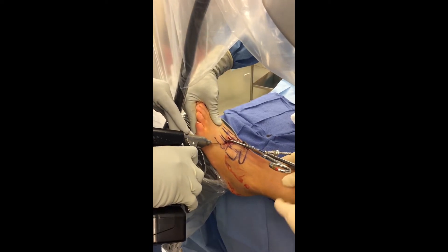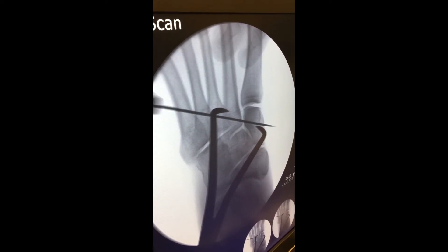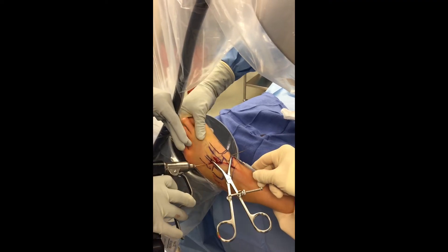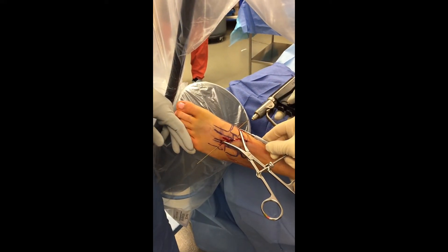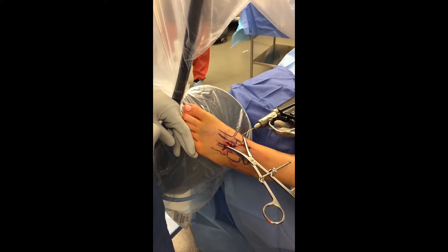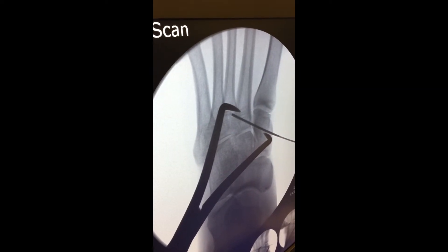A guide pin is then placed across the Lisfranc articulation. I recommend doing this in a retrograde configuration initially, exiting out the medial side of the foot. The pin can then be taken through the medial side of the foot and advanced back into position. This is technically a lot easier than trying to insert the pin antegrade, and allows this to be done under direct fluoroscopy without any additional guides, enabling exact anatomical placement and length of the guide pin.